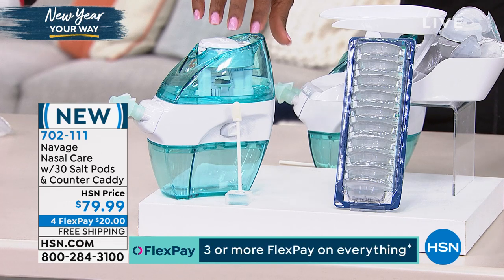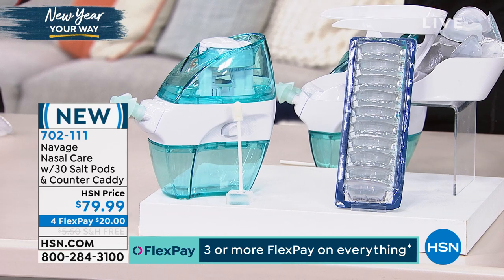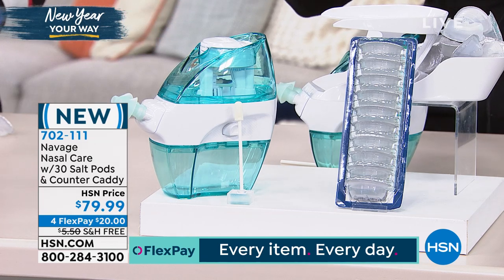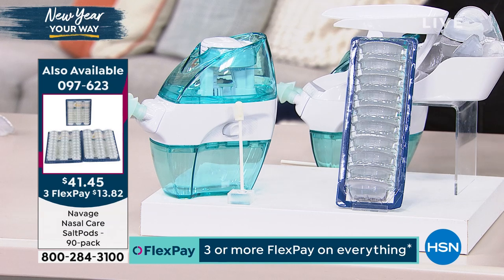It comes along with the system itself, with the caddy. This sits on your countertop, nice and contained. You're getting 30 of the salt pods that you'll use with your Navage. And just so you know, when you need more salt pods, you can always come back to hsn.com and get them — you can even put them on auto-ship, which is what we have at our home.